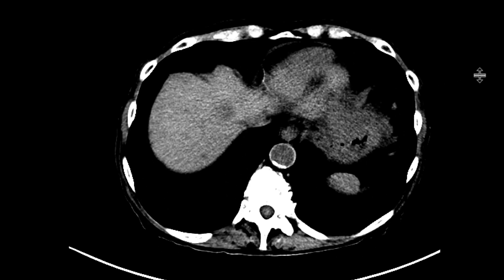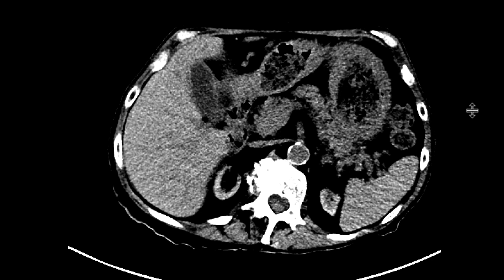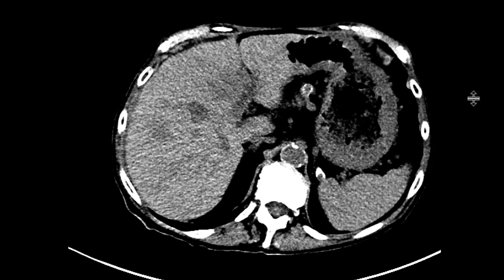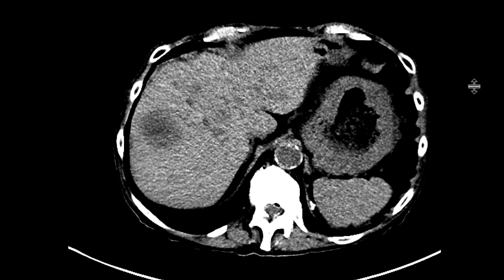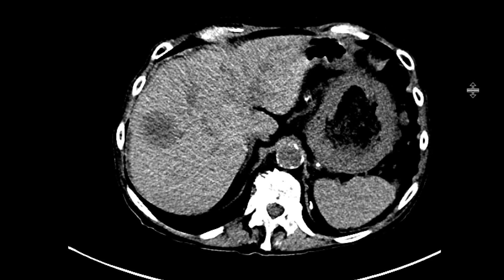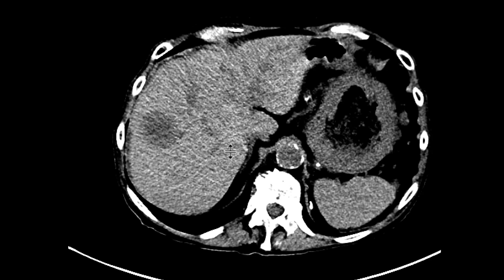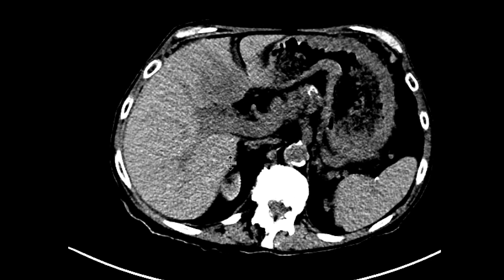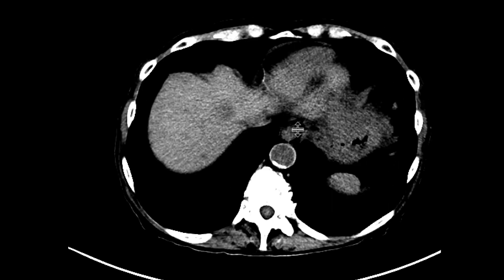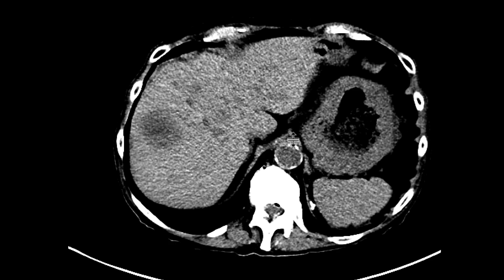This is a patient who comes in with abdominal pain and gets a CAT scan without intravenous contrast. On the non-contrast images we can see that there are several masses in the liver — one here in the right hepatic lobe, one a little bit higher, and one here in the left hepatic lobe. So multifocal liver masses, which in and of itself is nonspecific.